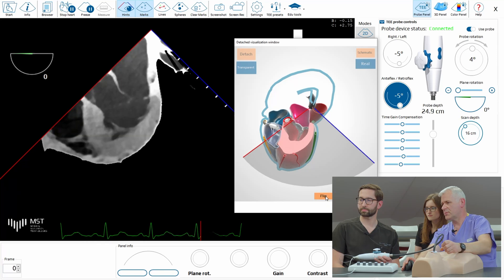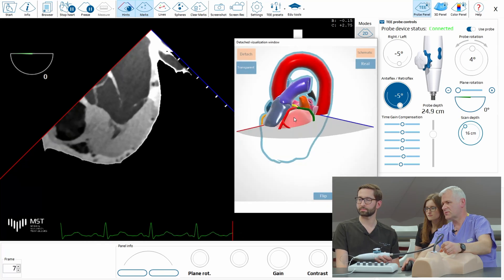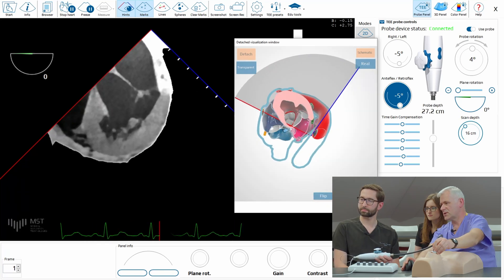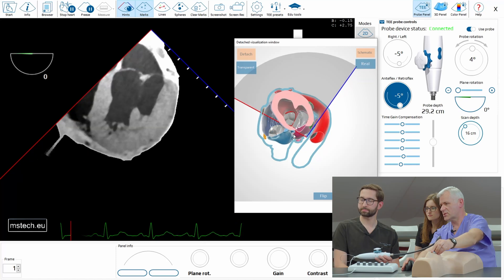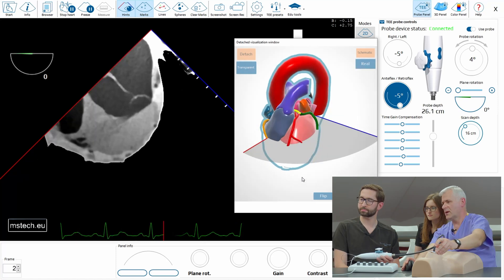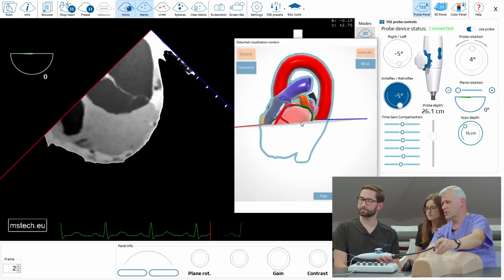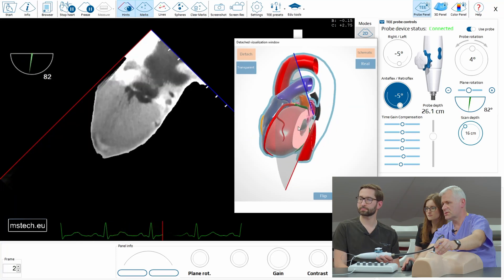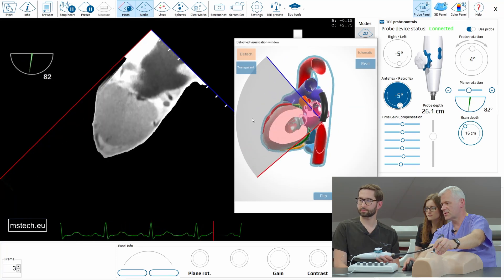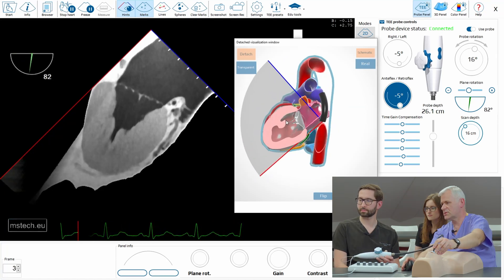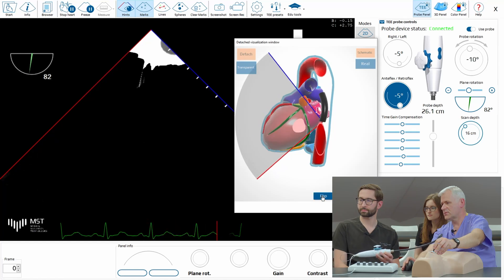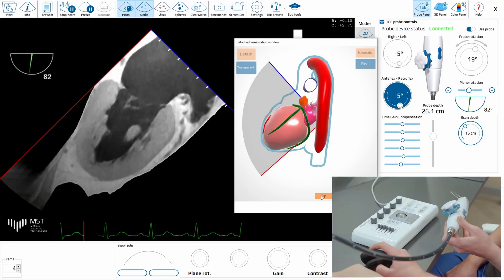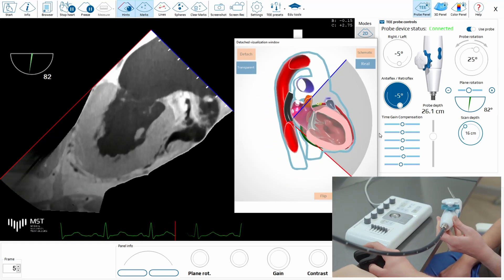If you wish, you can flip it and see it from the other side. Here you have the controllers for this function. Of course, if you have a longitudinal section, you will see corresponding images in a longitudinal way. Flipping will also show it on the other side.